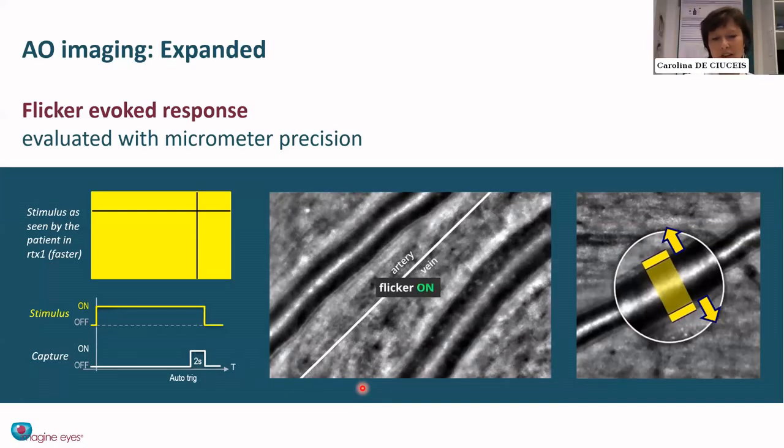Our interest in the assessment of neurovascular response is related to the possibility to investigate the microvascular functions with flicker light-induced dilation. After repeated stimulation of flickering light, both the arterial and the venous dilate according to the principle, as we said before, of neurovascular coupling.